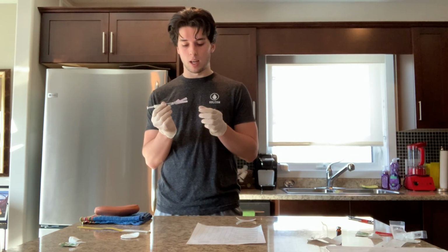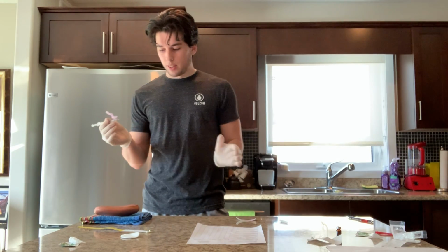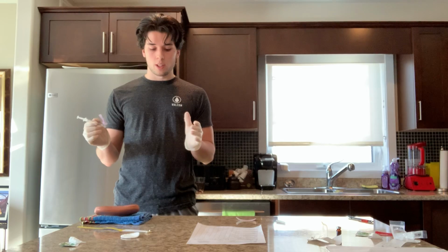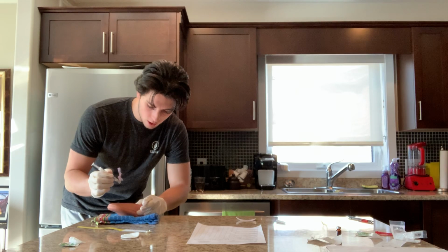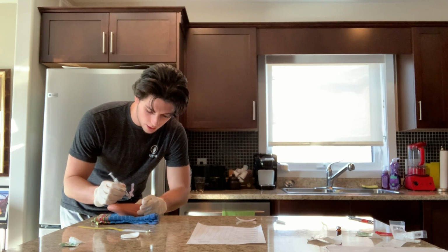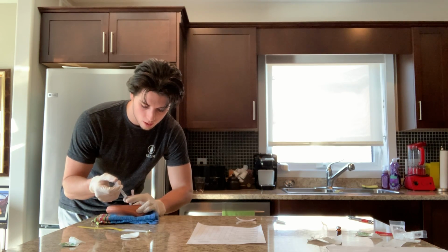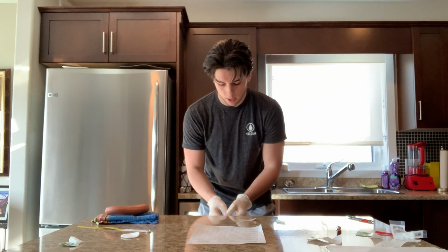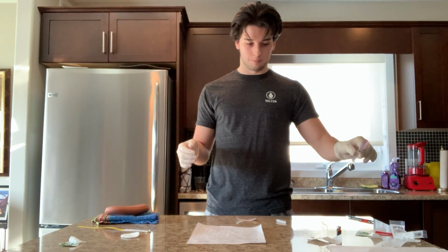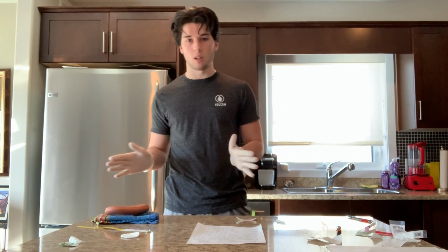So we can uncap our needle, and once our needle is uncapped, for this subcutaneous injection, we'll be injecting at 45 degrees, which means we need to pinch 1 inch of skin. So we will pinch 1 inch of skin, and then once we have pinched it, we will make sure our bevel is up, and we will inject directly into their abdomen, and then stabilize our syringe, inject slowly, and then once our medication is injected, remove our fingers, remove the needle, and we will activate our safety mechanism right away, and deposit it directly into the sharps. And now that that is deposited away, if we need, we will hold the cotton ball. In this case, we don't.